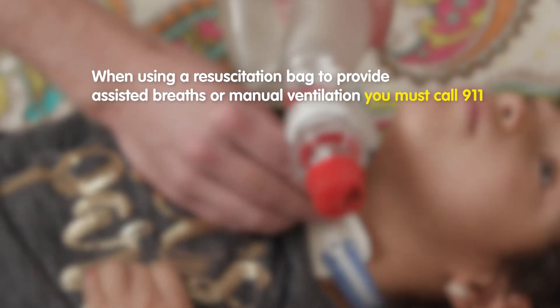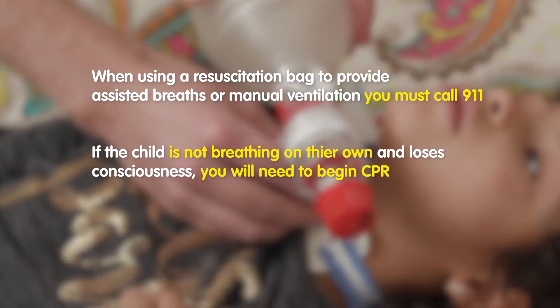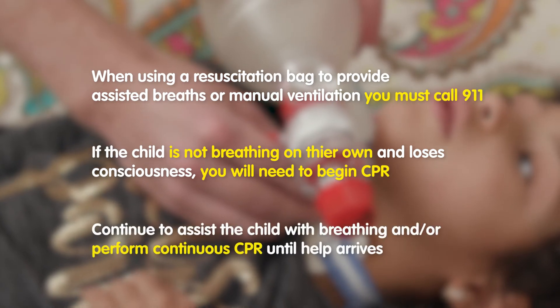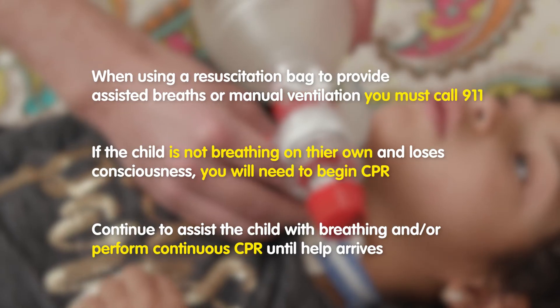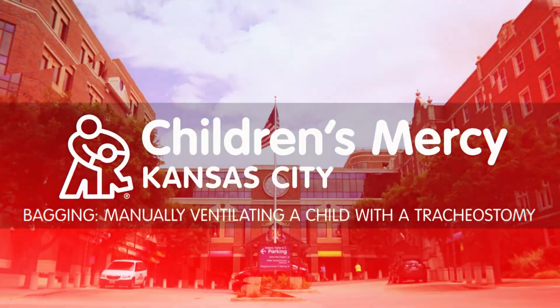When using a resuscitation bag to provide assisted breaths or manual ventilation, you must call 911. If the child is not breathing on their own and loses consciousness, you will need to begin CPR. Continue to assist the child with breathing and or perform continuous CPR until help arrives.